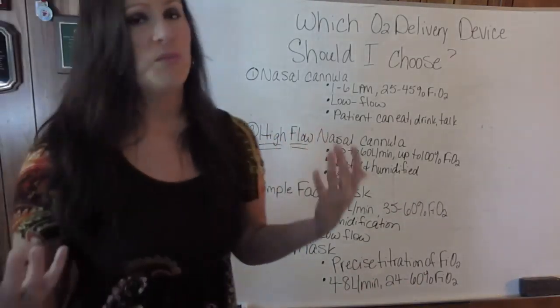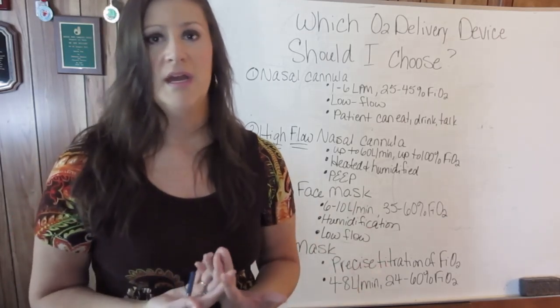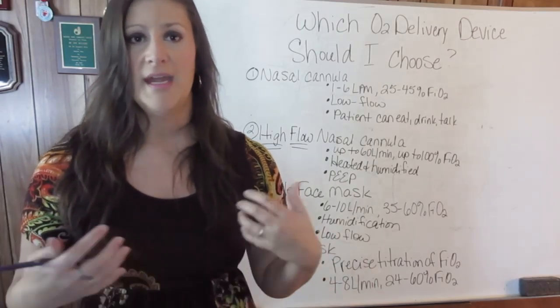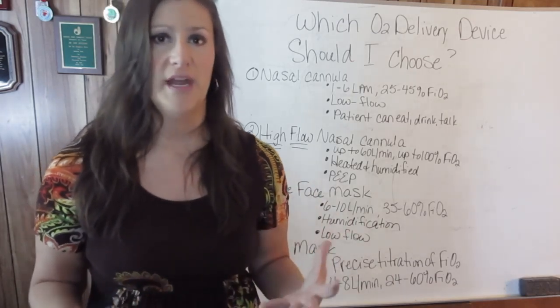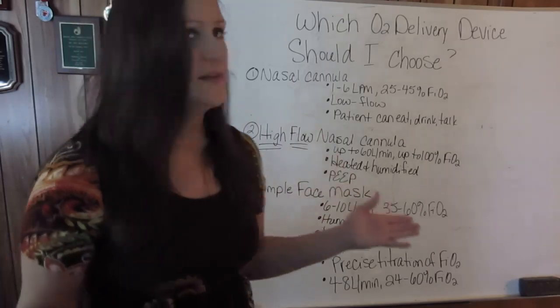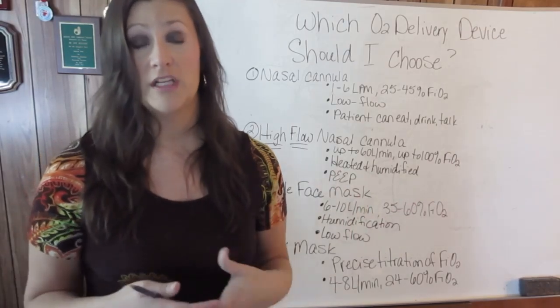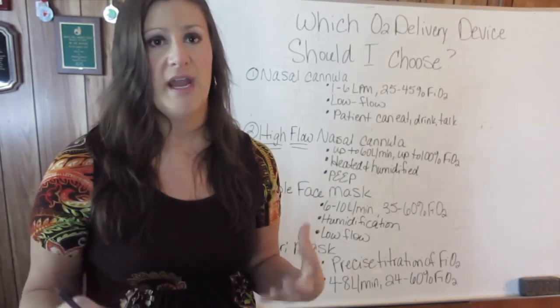Now you know that putting anybody on 100% FiO2 for a prolonged period of time is not good, okay? 100% FiO2 can lead to oxygen toxicity and can actually lead to ARDS and all kinds of other complications. But with a high flow nasal cannula, you're going to see that the tubing is much longer and it's green where I do clinical in the hospital. So that's how it looks different than just your typical nasal cannula.